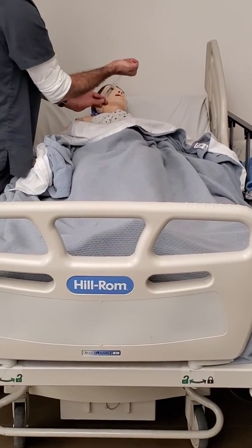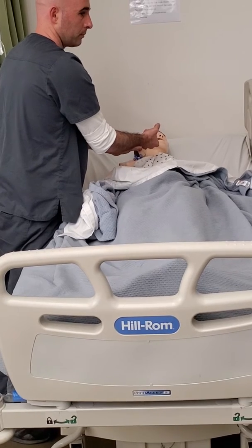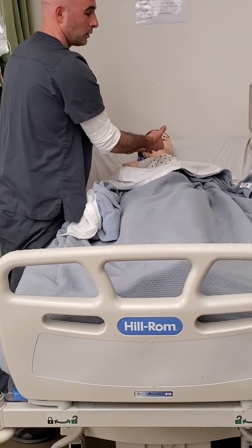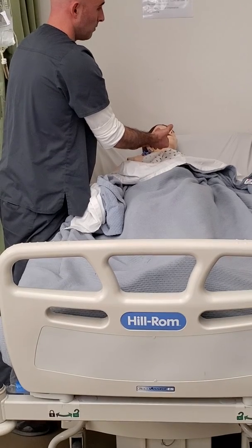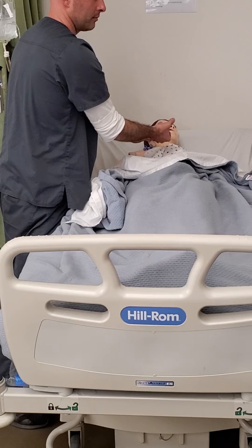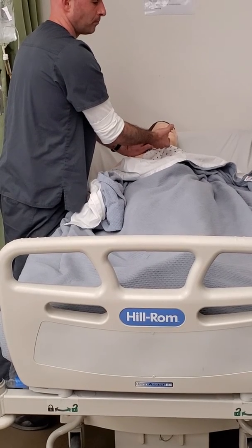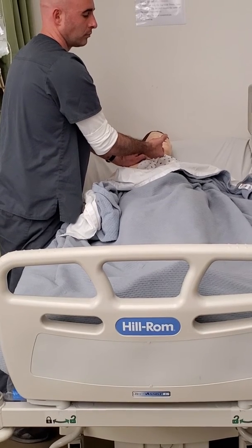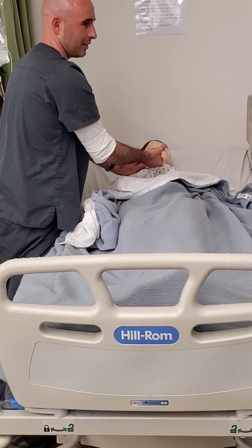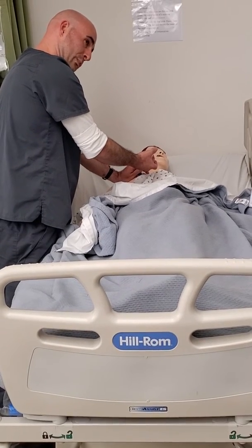I don't want to just jam fluid in there. But if you're pushing in with one smooth motion and there's an occlusion, you're not going to be able to go anywhere anyway, right? So there's a different rationale for the push pause. So you're getting rid of any clot at the bottom, or at the cap. Hopefully there isn't one, but you want to prevent it, right?